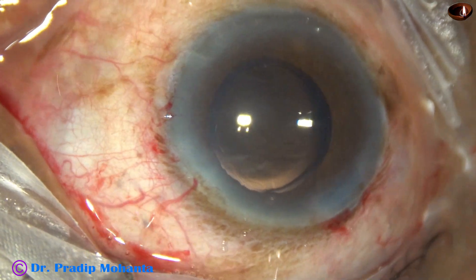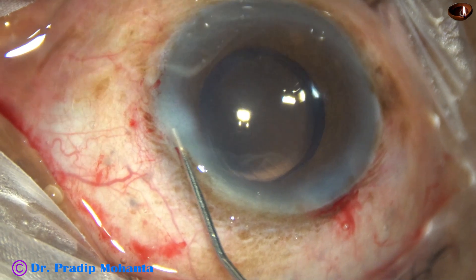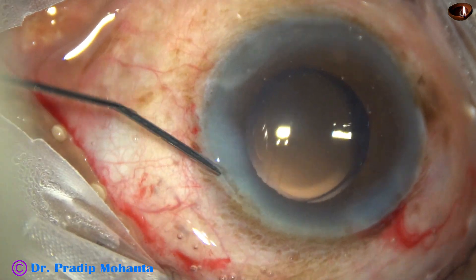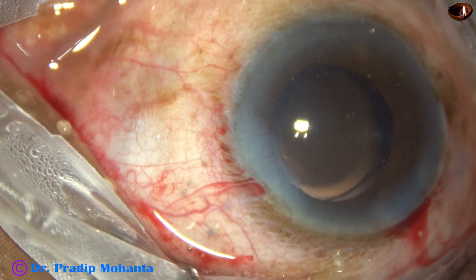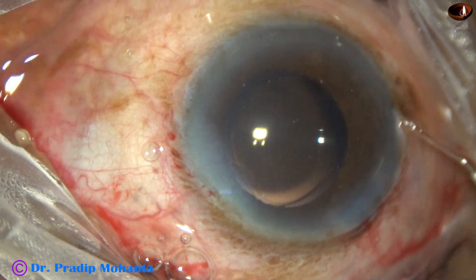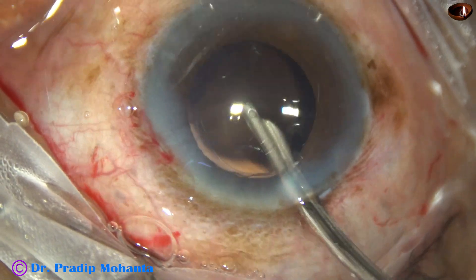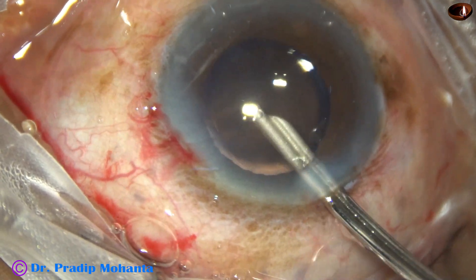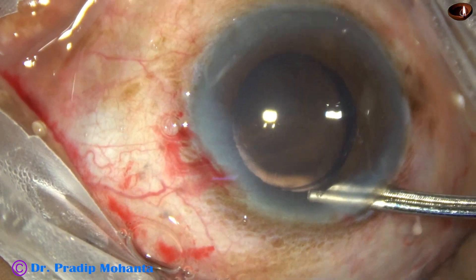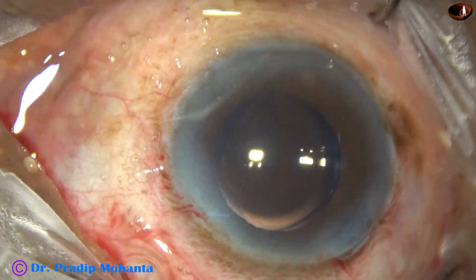This is a bit of moxifloxacin. Now I hydrate the corneal stroma and close the side port. This is the final lavage of the anterior chamber. The anterior chamber is thoroughly lavaged, the anterior chamber is formed, and the case is concluded.